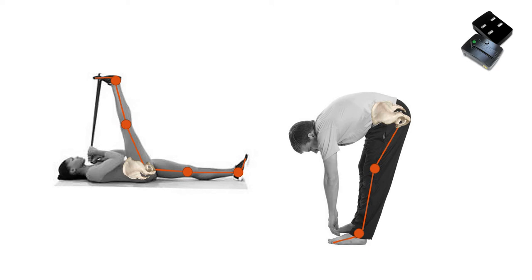This helps keep the pelvis, rather large pelvis there, I've just realised I've animated on it, in a relatively fixed position, whereas the person on the right, and you have to look carefully for this because it's a very subtle animation, because he's touching his toes, the hamstring will try to shorten in whichever way it can.